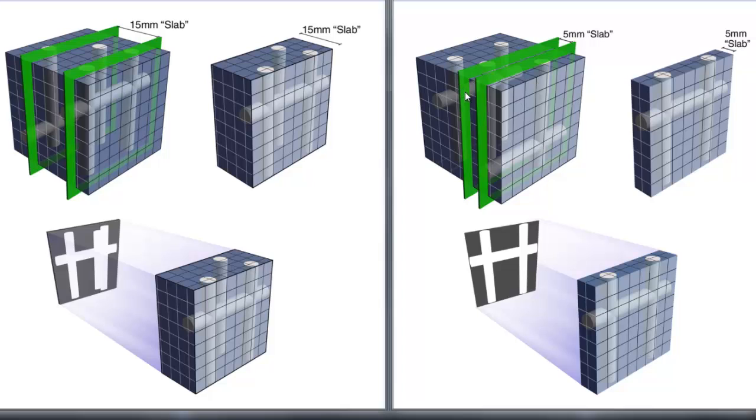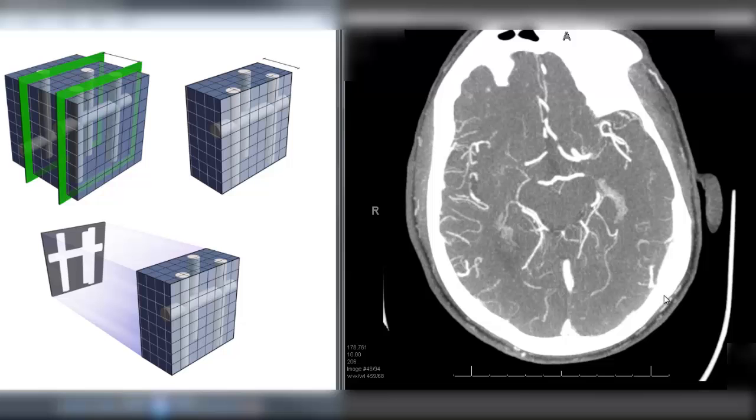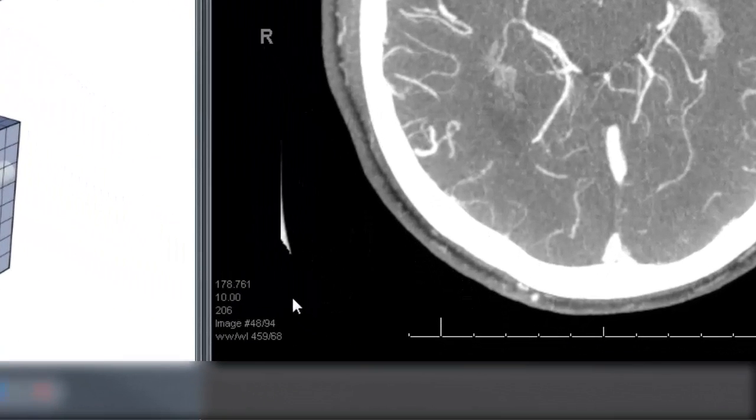Sometimes these will be 5 millimeter thick slabs, sometimes it will be 10 millimeter thick slabs depending on the protocol used on the scanner. When you're looking at a thick MIP reconstruction in any plane you can see the thickness, the slice thickness provided in the DICOM overlay typically in the bottom left hand here.